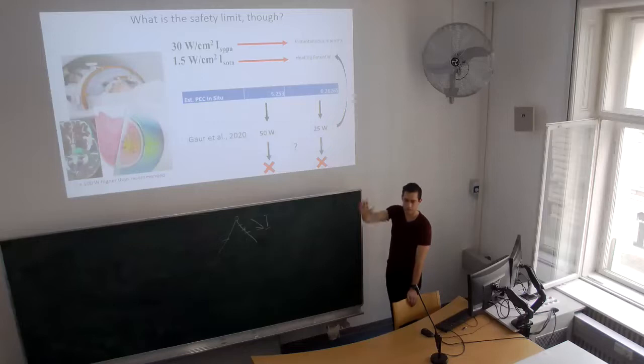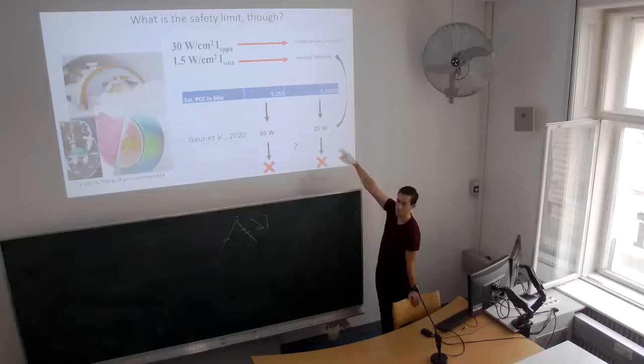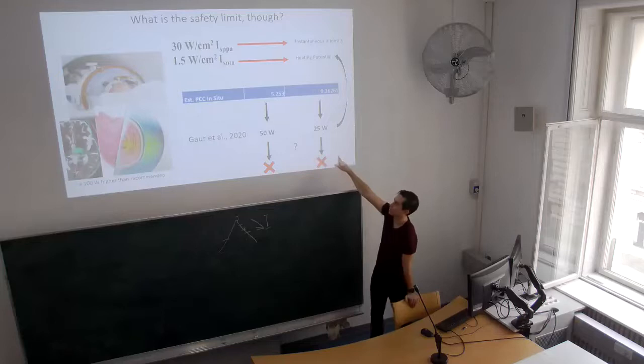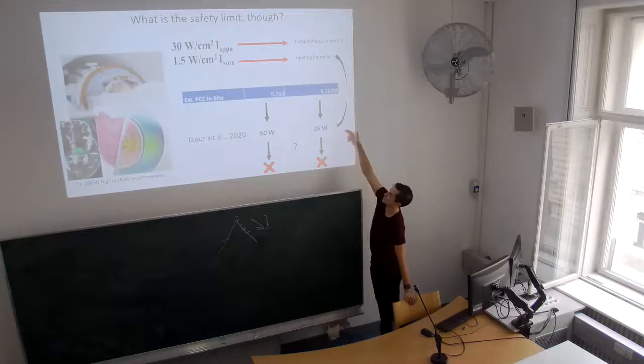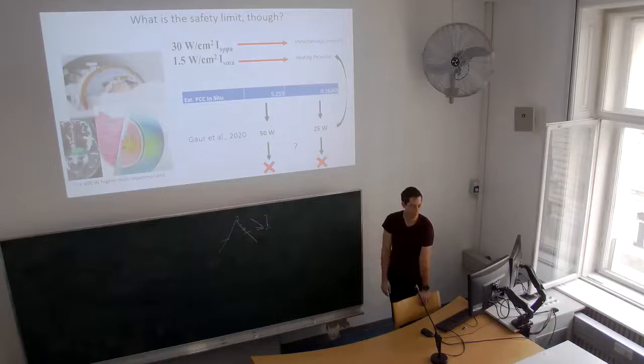So we actually don't know what the upper limit is, because everyone goes up pretty high expecting to maybe start finding something, but they haven't ever quite gotten there. For all the safety studies, there have been some incidental things here and there, but they're probably not related. So we really don't know what the upper limit for intensity is. But there's no reason to go there, because you wouldn't want to get close to this either, of course. That full range between what I do and what they have here is going to be probably comfortably neuromodulatory, and that's what you want.